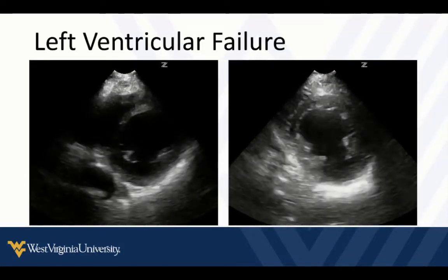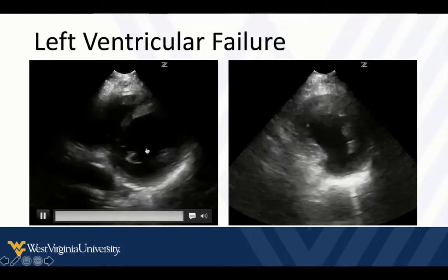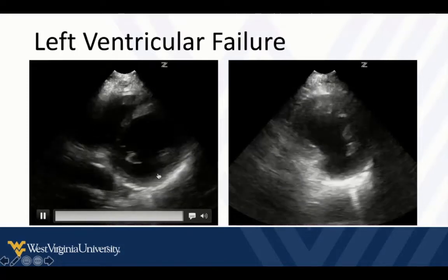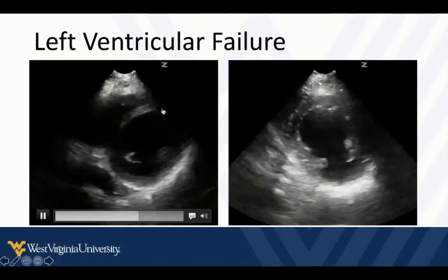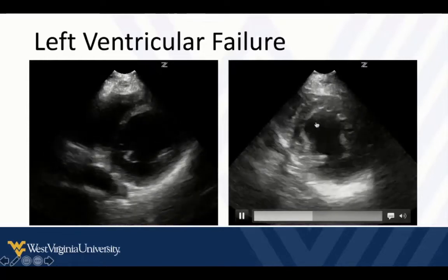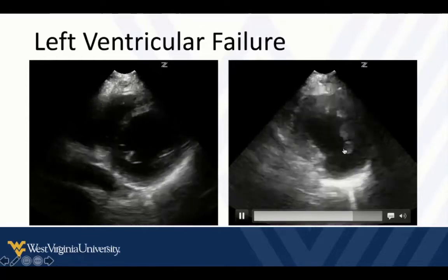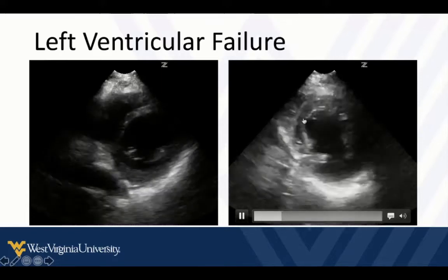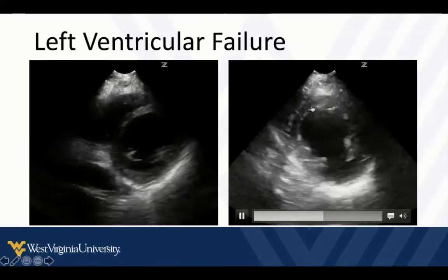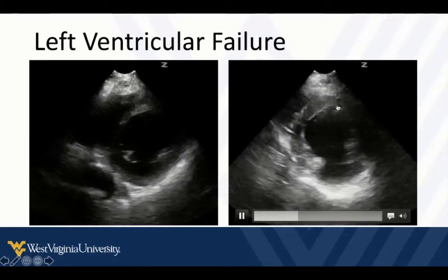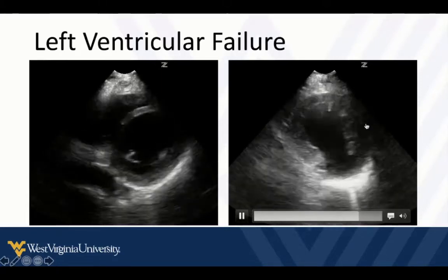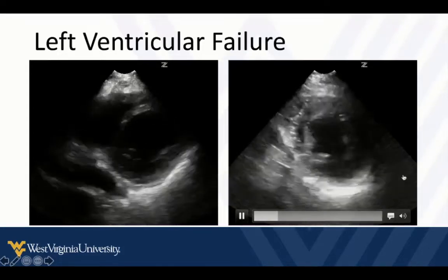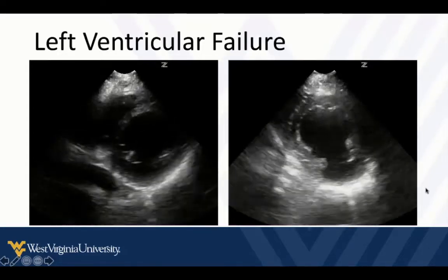Here are some short axis views where we can see the endocardial borders pretty well, and there's really just not much volume changing and not much thickening going on. Similarly, the volume is not changing much here. We do have some regional wall motion abnormalities — pretty good thickening up in the anterior septal wall, but this posterior lateral wall just really isn't doing much at all. These are people with failing left ventricles.